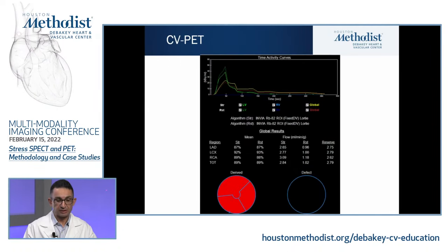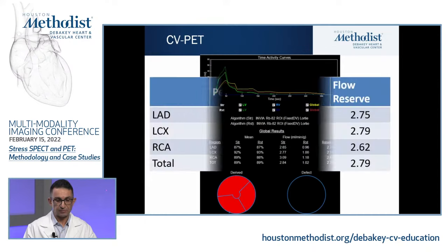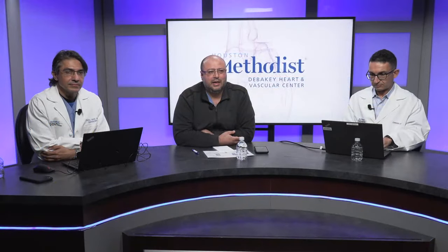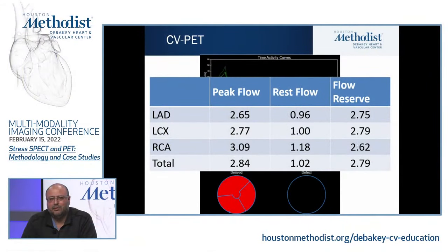This was his myocardial blood flow quantitation, and all the numbers in this setting were pretty much normal, with normal resting blood flow, normal peak myocardial blood flow more than 2, and a very good myocardial flow reserve. So this is one situation where the blood flow has been questioned in terms of its added value among patients post-bypass surgery, because these patients may have collaterals, so the blood flow is not only dependent on just a vasodilatory effect on the coronary arteries, but now you have the grafts, you have collaterals, you have severe calcifications, and it may not be easy to outline.